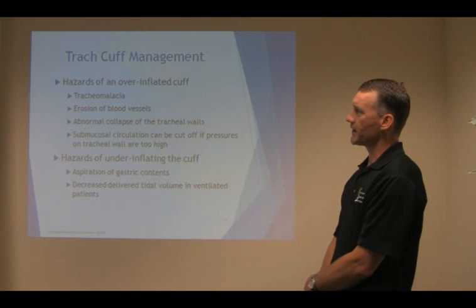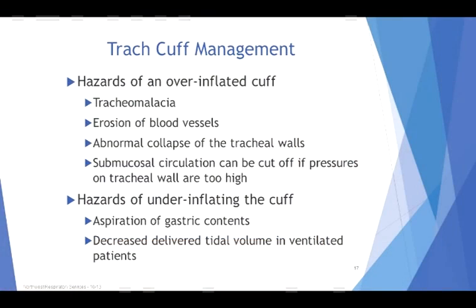Hazards of an overinflated cuff: tracheomalacia, erosion of the blood vessels, abnormal collapse of the tracheal walls. Submucosal circulation can be cut off if pressures of the tracheal wall are too high.